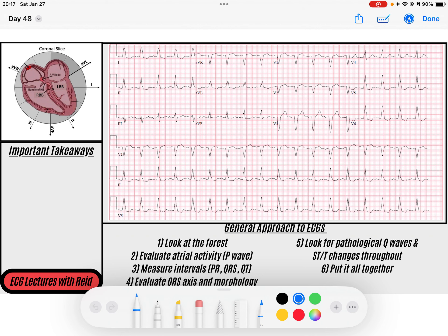The first thing I like to do is look at the forest, and the trees of the forest are my QRSs. So I'll come down here to this V5 rhythm strip. What do I notice? I've got this wide complex QRS that is occurring regularly, consistently. I don't see any drops as I scan through the whole thing.